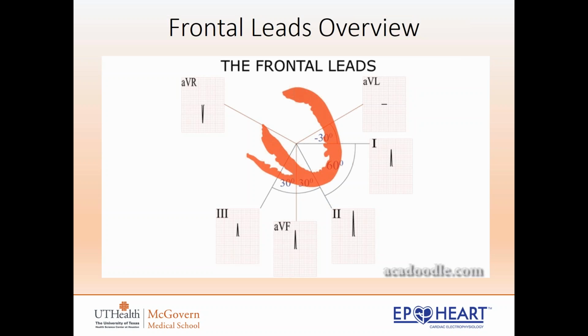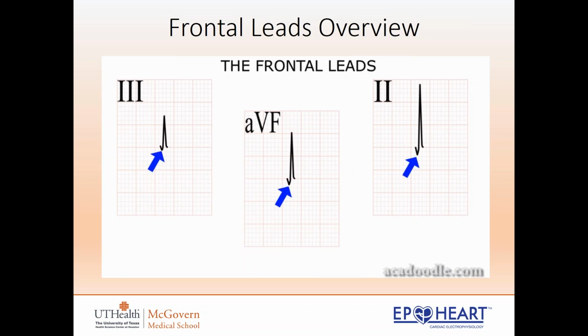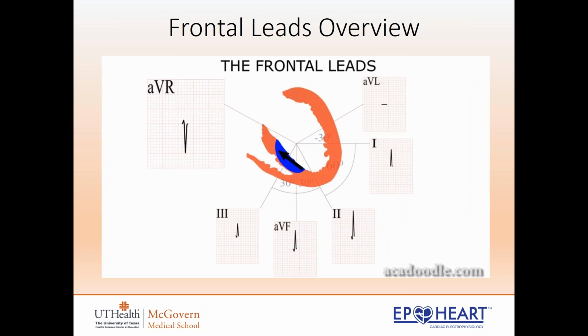Again, we note that septal depolarization begins before the main muscle mass of the left ventricle depolarizes. And in this plane, septal depolarization is not only moving from left to right, but also upwards from the diaphragmatic aspect of the septum. So this early septal current is moving away from the inferior leads. Therefore, it is not uncommon to see physiological Q waves in these leads, and an initial R wave in AVR.